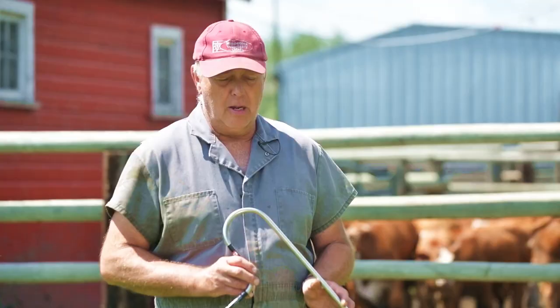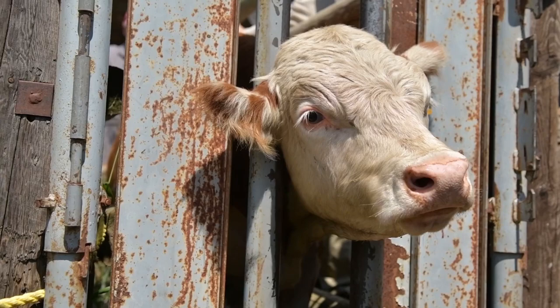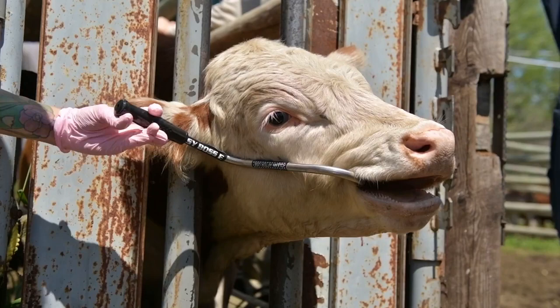There are applications that we haven't had hands-on experience with yet, regarding the use of growth implant insertion. I have used it for some dehorning applications and the administration of oral pain control with oral meloxicam.